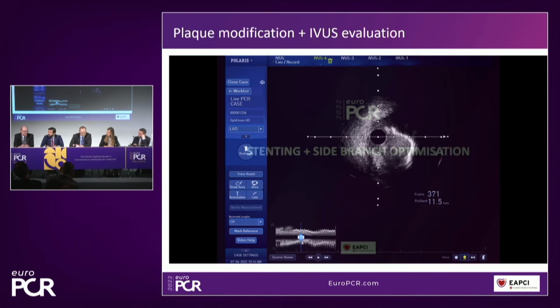Yeah, I have to say I don't use a lot of cutting balloons. I think you're right that they're good in the proximal vessel, and the nice thing about them is they're accurate. They stay where they want to be, and they don't slip as you put them up, because actually that is the real hazard in calcific disease, that you end up then extending or dissecting or doing high pressure in an area which you didn't really mean to be in. So I think that's a real benefit of cutting balloons. But my use is quite small.